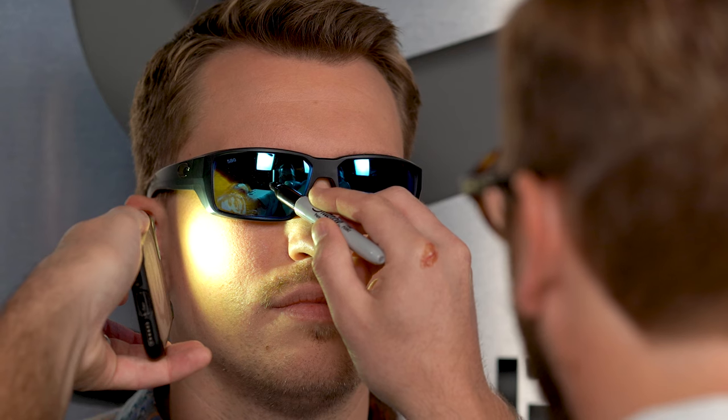The easiest thing to do is just use the light on your cell phone. Everyone has cell phones these days and they all have flashlights. Just shine that flashlight behind the lens and you're going to be able to see their eyes so you can mark it just the same.